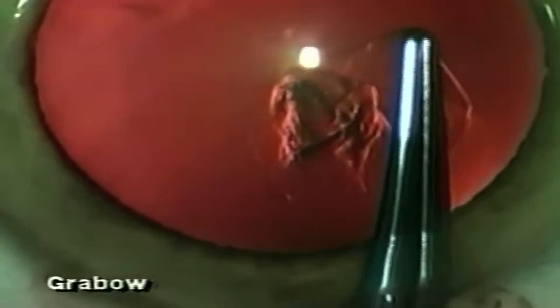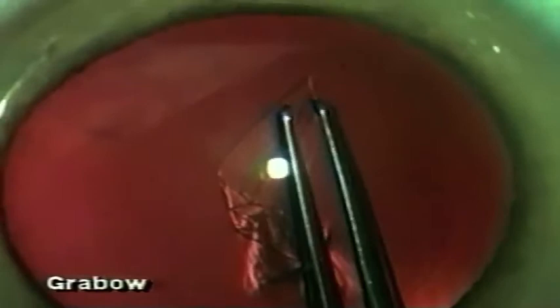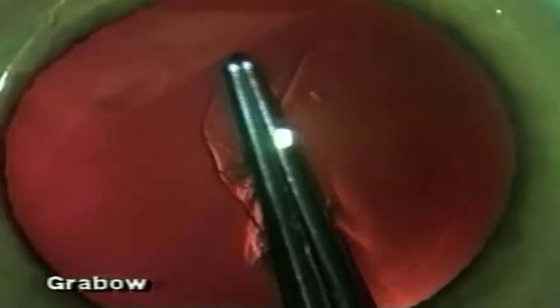The handle is rounded so that the capsulorexis forceps can be rotated in the fingers for precise control, and the handle is also hinged, which comes apart at the very proximal end for cleaning and for adjusting the tension of the forceps to suit the surgeon.